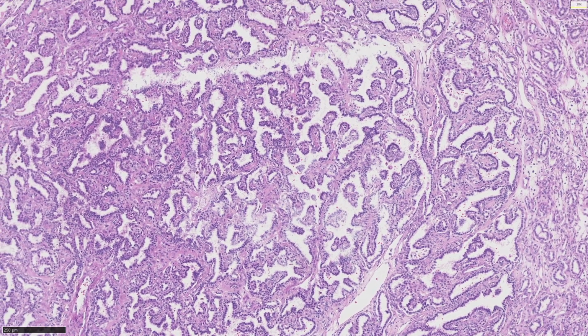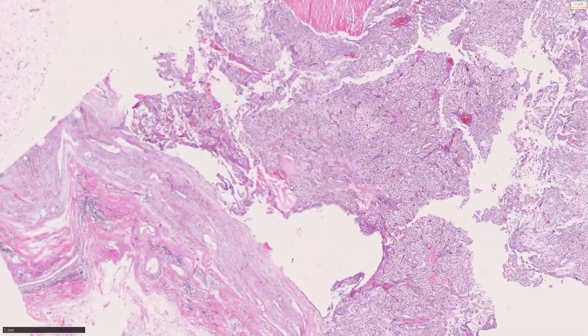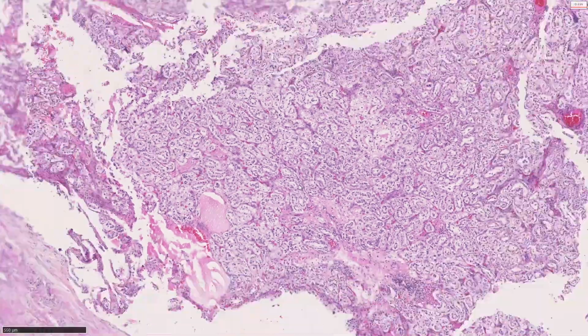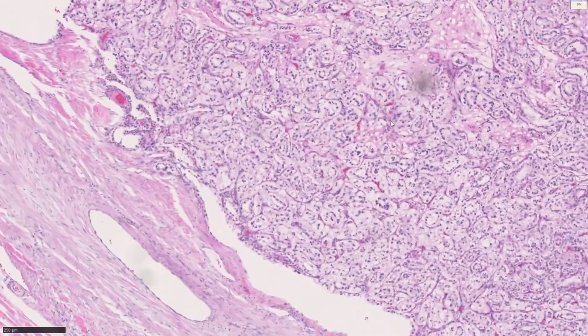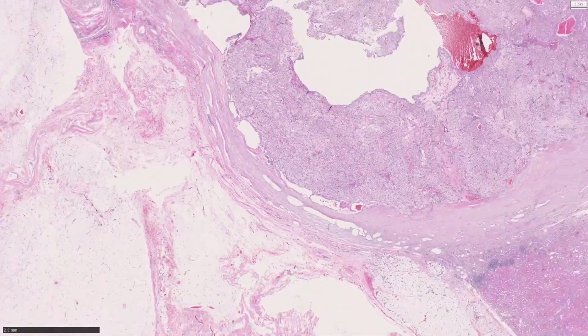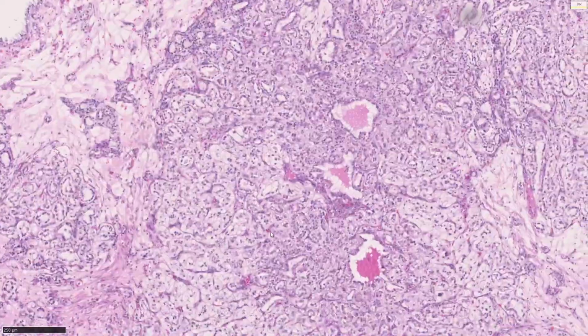What if this is a papillary renal cell carcinoma? Let's keep looking around. And here we go. Here are some packed tubules. Note that regardless of the architecture, the tumor cells are clear cells with low-grade nuclei. You may ask, then what is it that set this one apart from our usual clear cell RCC?